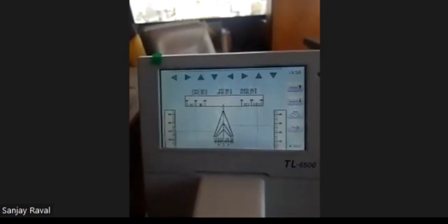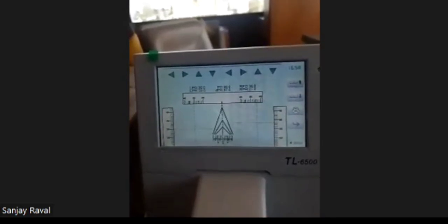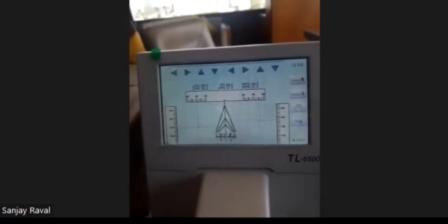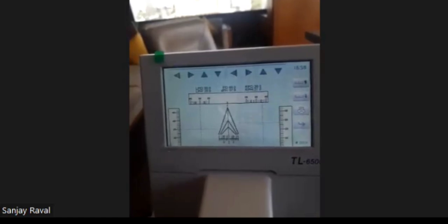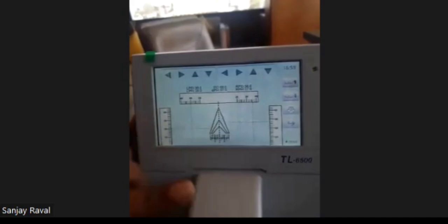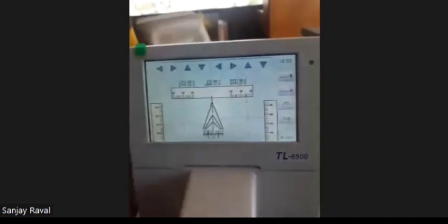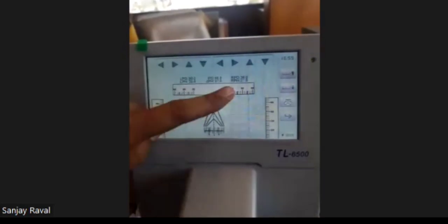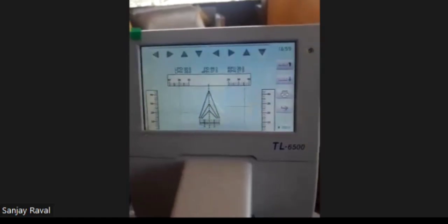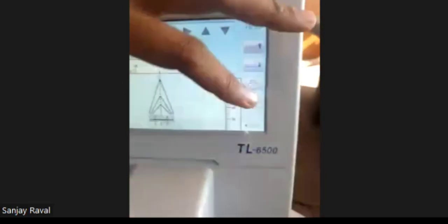This is very much crucial when one is using the three-piece lenses, three-piece frame, where loosening of the lens holding itself invites a lot of problems for the patient. So this gives the right PD and left PD individually as well as the total PD, and apart from PD, it gives the height also, the pupillary central height of the corridor. Right. This is fully a mechanism.